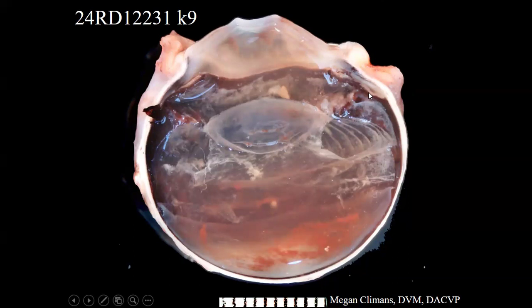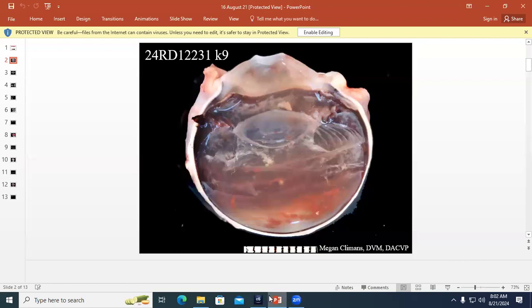So the iris itself is this pale brown leaflet here. And then everything in front of that is all this abnormal white-tan tissue that's carpeting the iris. And there's also a little bit of vitreal hemorrhage visible down here. So let's now move to the histology.